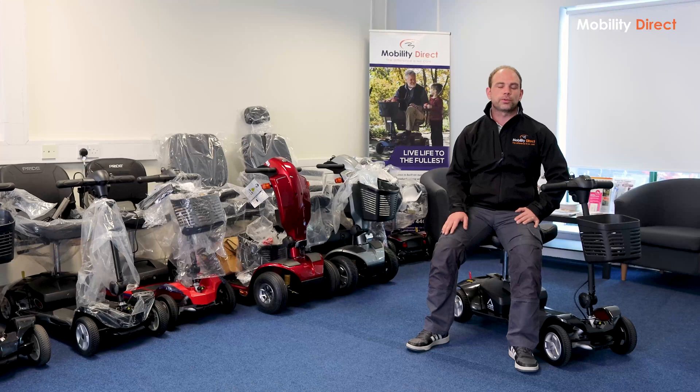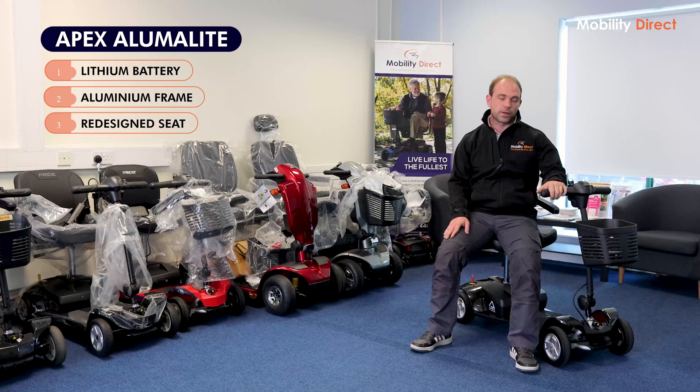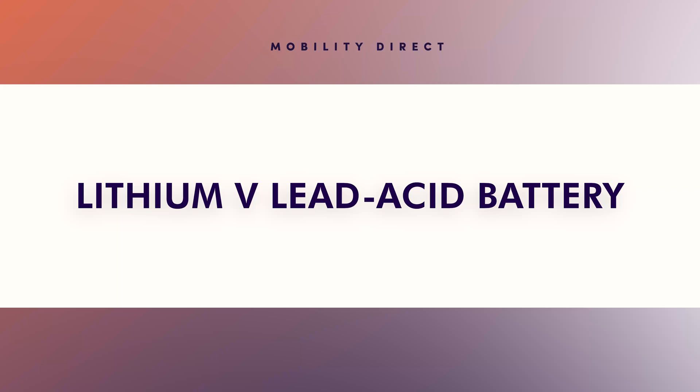So to begin with, this model is based on the older Pride Apex Light scooter, which would be considered an entry-level four-wheel travel scooter. They've taken that model and essentially redesigned it to make it lighter. They changed the battery from lead-acid to lithium, changed the frame — the main body or section of the scooter — to aluminium, and they've also redesigned the seat, all just to make it lighter. Overall, it's over 30% lighter than the original version.